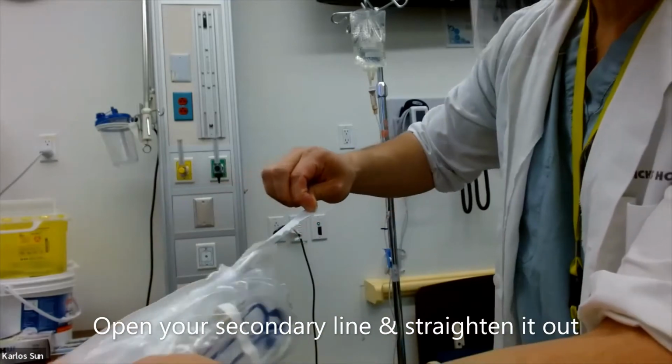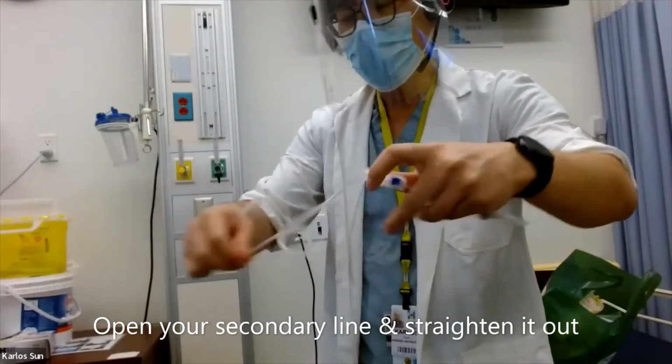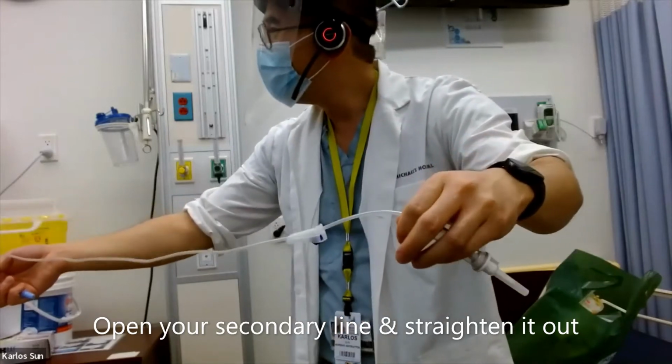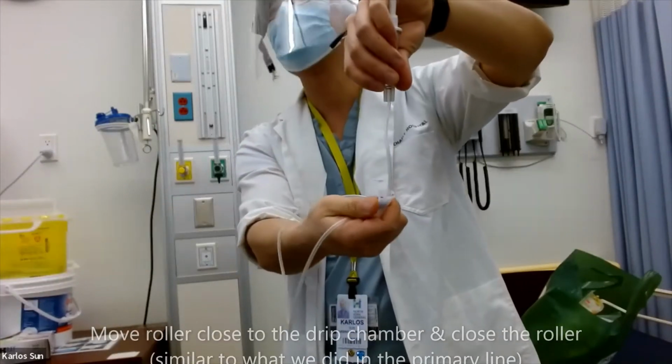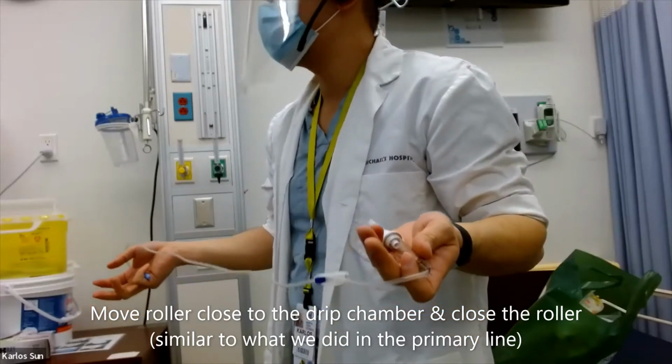Open your secondary IV line from its container and straighten it out. Move the roller close to the chamber and close the roller.